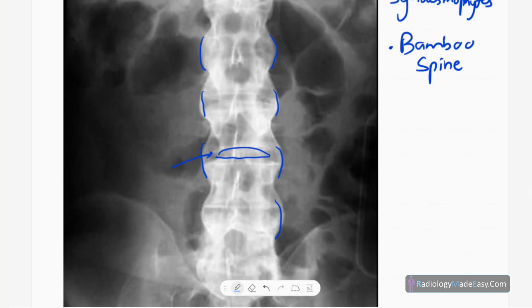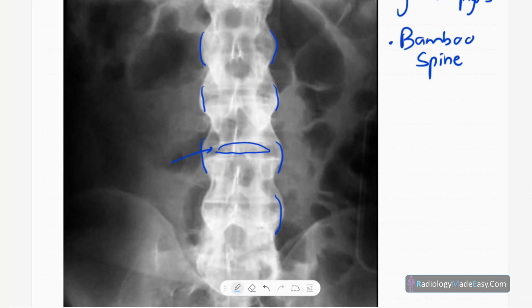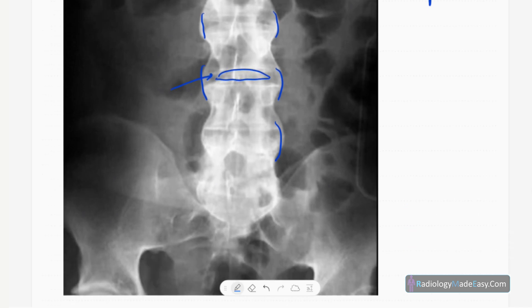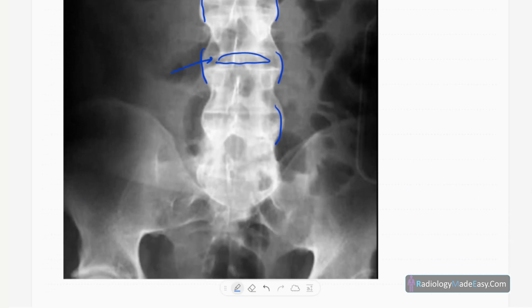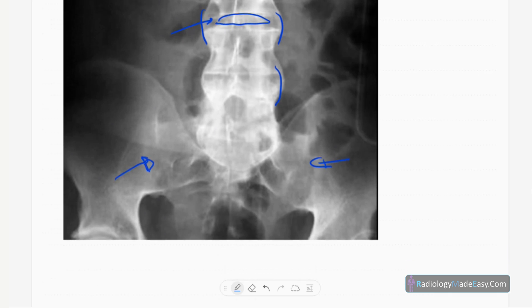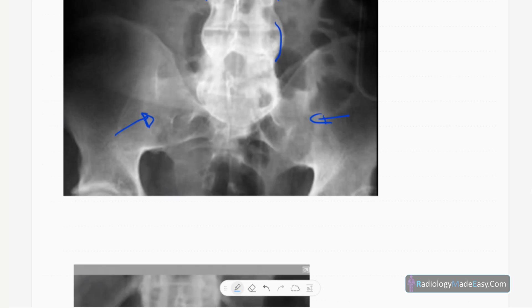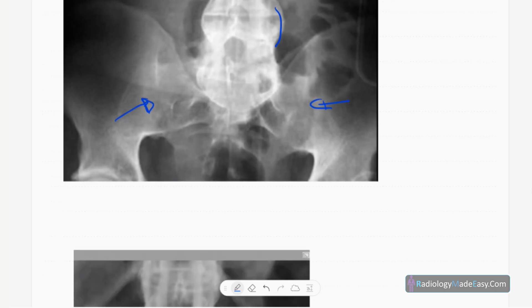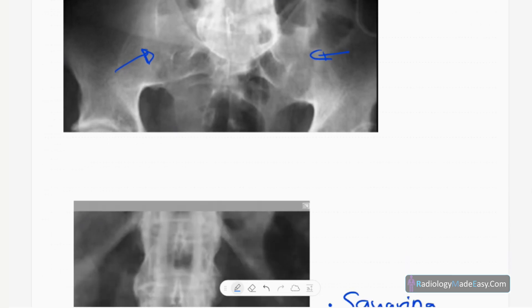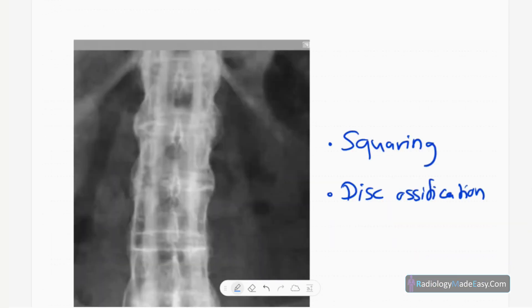This gives rise to the appearance of bamboo spine. You can also see fusion of the SI joints — you can hardly see the SI joints. This is ankylosing spondylitis with symmetrical involvement of the sacroiliac joints.